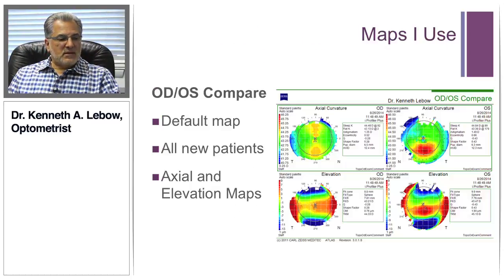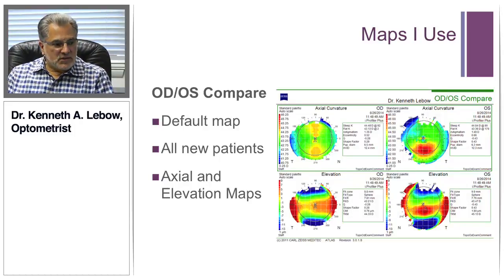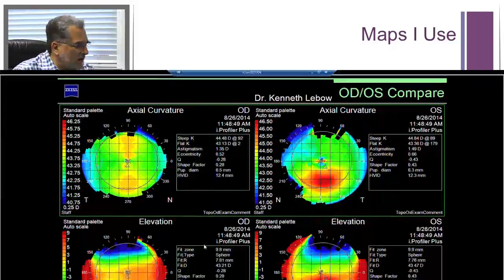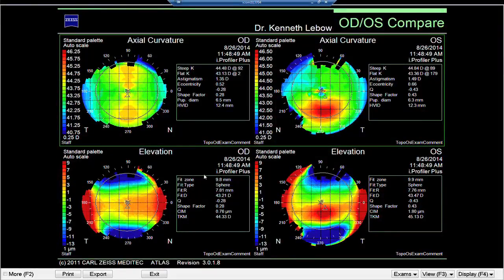The maps I use primarily are the right-left compare map. What you see on screen is an interesting case I saw just a couple of days ago. The patient came in wanting contact lenses — the husband, coincidentally, is a keratoconic patient I had just fit before. My staff will always pull up the right-left compare map so I can get a lot of information about that patient immediately.